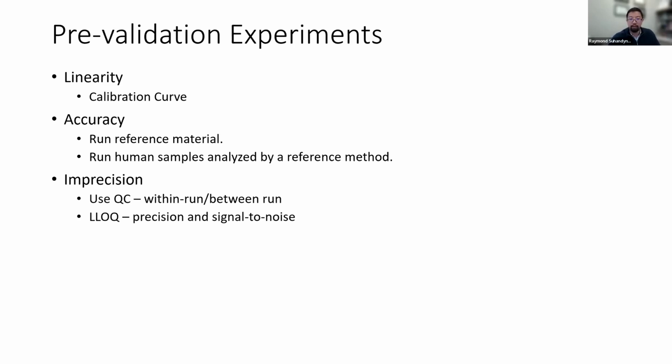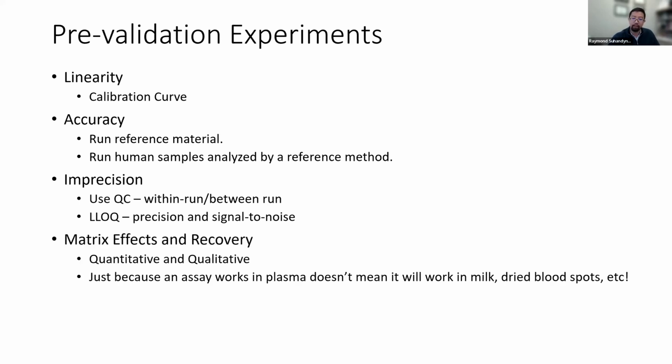The LLOQ affects this. So if all your specimens are being analyzed and measured at the lower limit of quantification, then that typically is more imprecise, and that's something to consider.